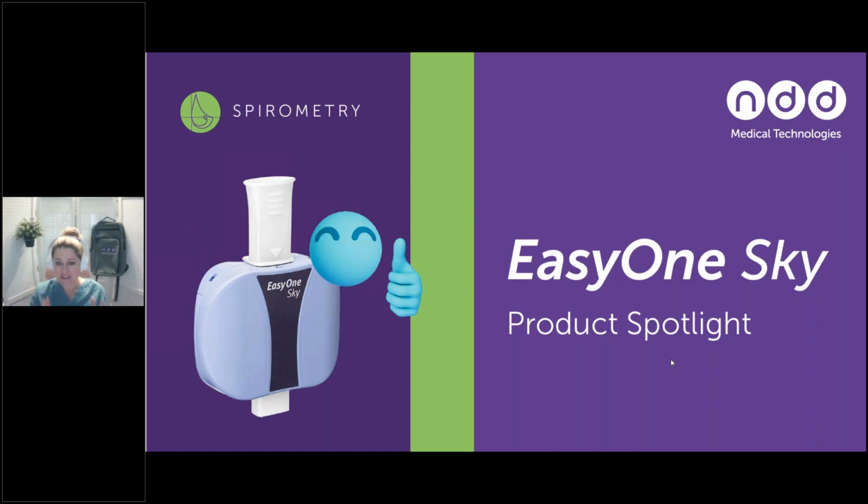Today, we are going to be focusing on our newest spirometer, which is the EasyOne Sky. And we are excited to go through and do another training on this device.